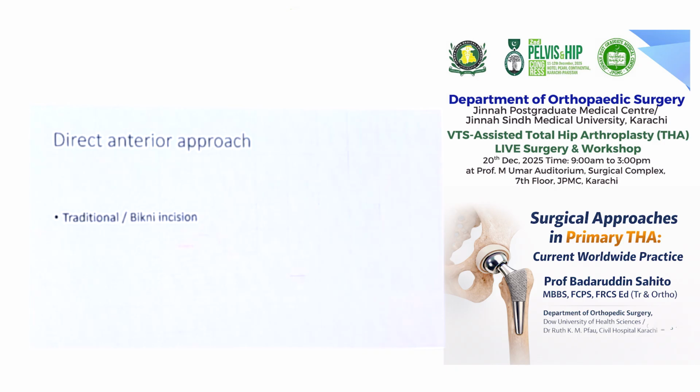So now everybody in Europe turned to the thing that the anterior approach is the best, but this again is the key. When you need the anterior approach, you need special instruments. It's not that you will put the same instruments in and do this total hip replacement through the anterior approach. The key is you must have all the equipment available on the table that helps you to do the anterior approach.